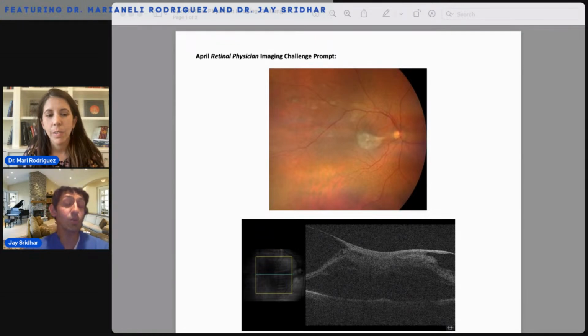And I think also you can get yourself into trouble. I think we've all had these patients where you'll have an ERM that keeps going. It will go to the arcade and it will go to the periphery. And if you keep going, you're going to tear the retina at some point, especially if it's an eye with a history of surgery or a diabetic retinopathy eye. So I generally just get it off the fovea. Anything else that's easy, if it comes off, I'll take it. But in my opinion, you don't need a huge circumference around the fovea. But again, there are many different ways to approach this.